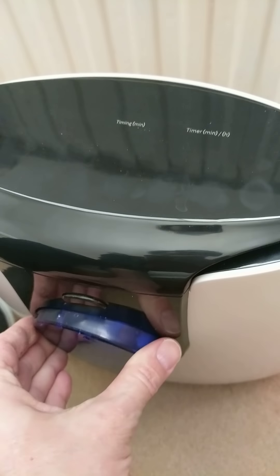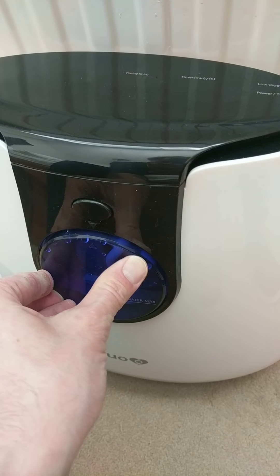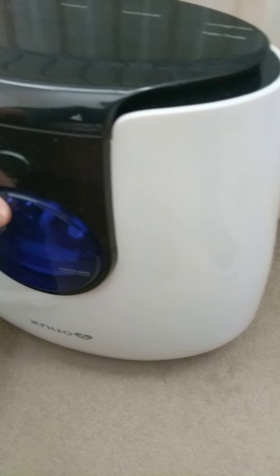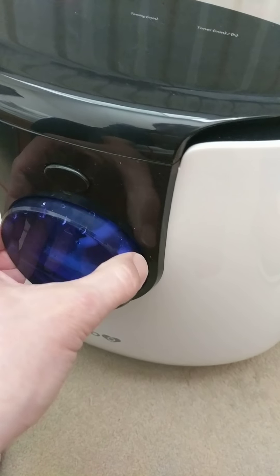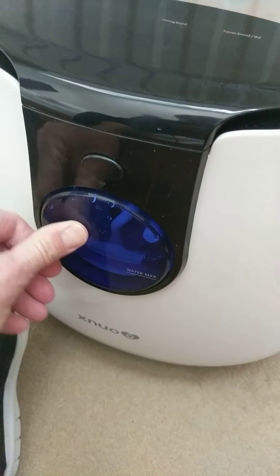I do find it tricky putting this in correctly. This tank is probably the worst thing about this unit so far. You think that's right but you never quite know.